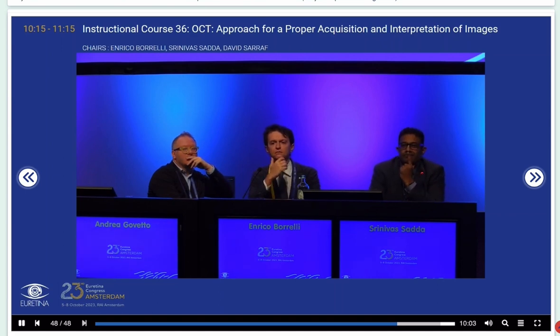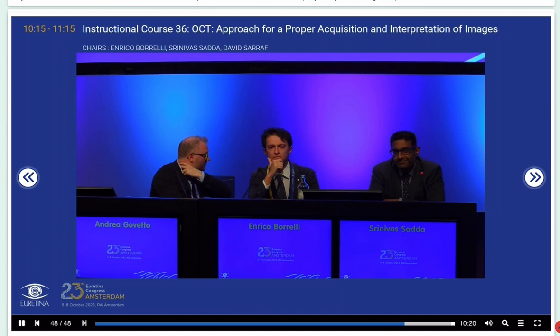There is another terminology called SIRE, shallow irregular retinal elevation. Is it synonymous with your double layer sign or flat irregular pigment epithelial detachment? And a final comment really is, when there is so much confusion about biomarkers, is there something being done internationally to standardize these terminology and definitions so that there is consistent use across the globe?